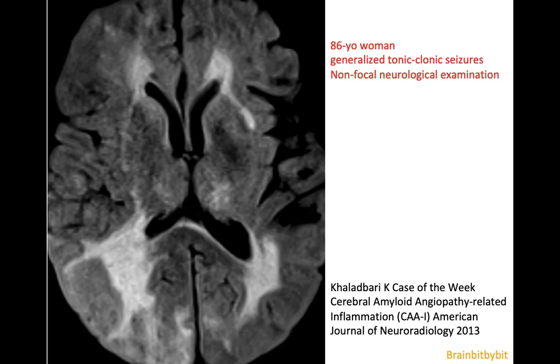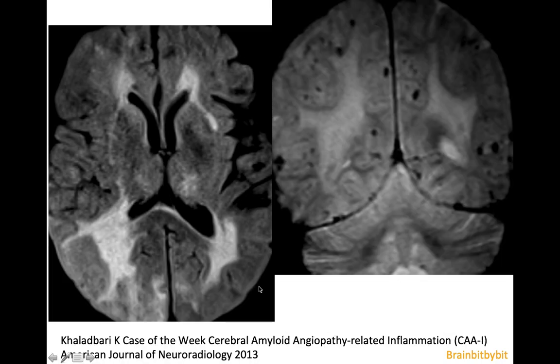This is an example of an elderly woman presenting with seizures and no focal neurological deficits. If you had not seen the previous slide, you might think this FLAIR image with extensive white matter abnormalities represents vascular white matter disease, or if symmetrical, a metabolic cause. But if you also look at the gradient or SWI images, you can see the cause: the microbleeds.